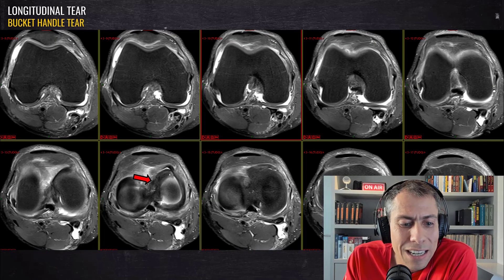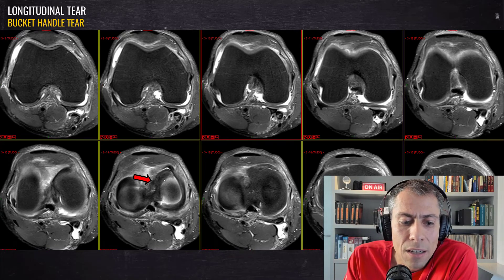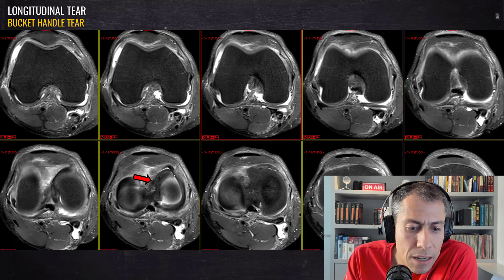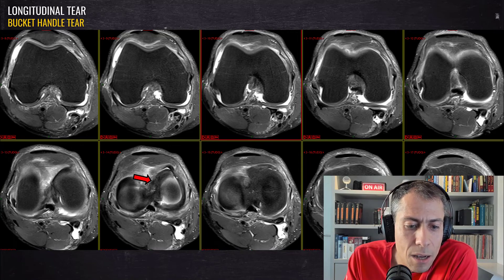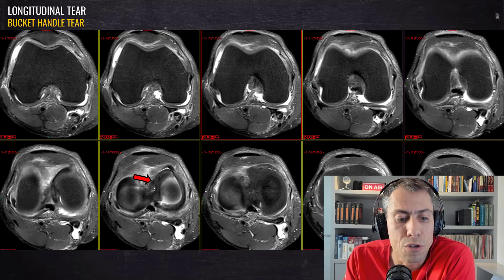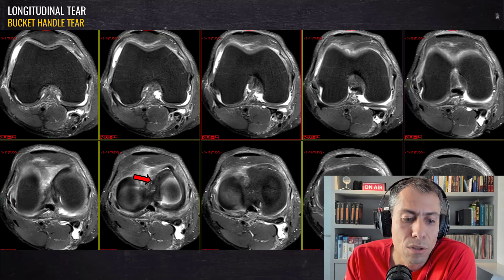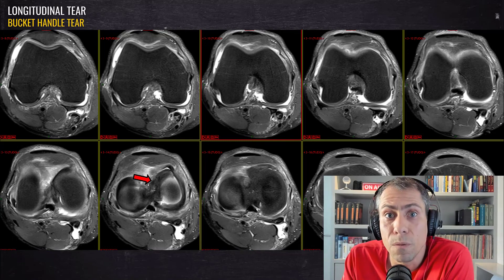Here we can also see in the axial plane the fragment in the intercondylar region of the knee. Here is the native meniscus — that's the periphery of the meniscus — and here is the huge bucket handle tear fragment in the middle of the knee, in the intercondylar region.